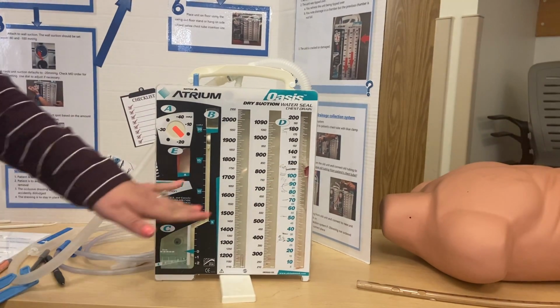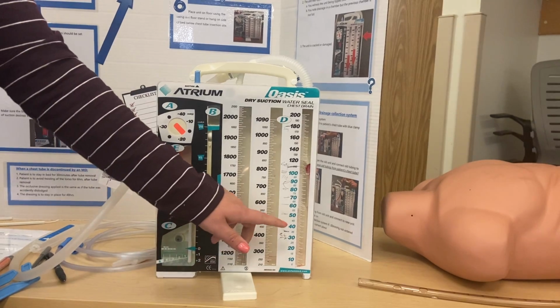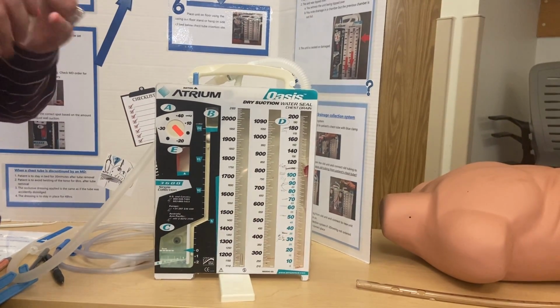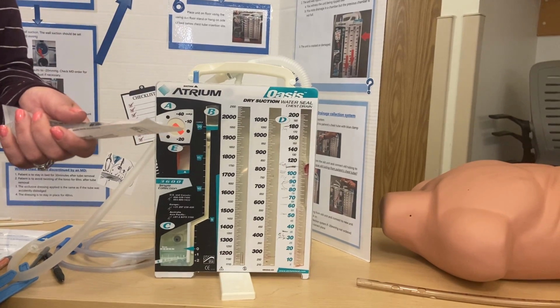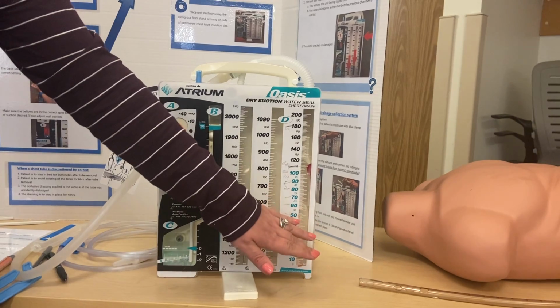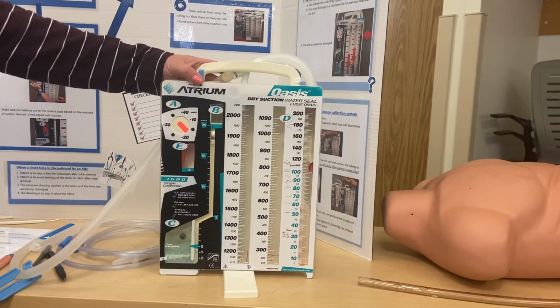What you want to do is keep a running tally of the output each shift. So you can either denote it by marking right on the canister, or you can put a little piece of tape and put the date and the time, just so that people know, okay, on day shift they had 50 cc's out, and go from there. And then you want to document it.